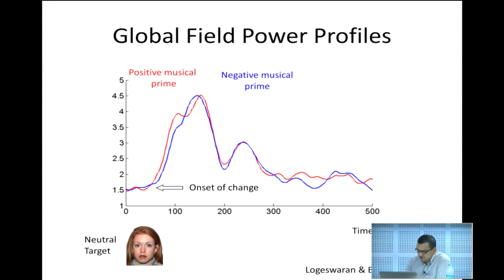This is an example from our own study quite a few years back. Because it is an exploratory method, we wanted to find at what latency two conditions differ. The details of the conditions are not that important here. There is a condition 1 and condition 2. From the ERP point of view this is a very good design, because in both conditions subjects are looking at identical stimuli. Only what happened beforehand is different. So it is comparing identical conditions. Only the priming was different.